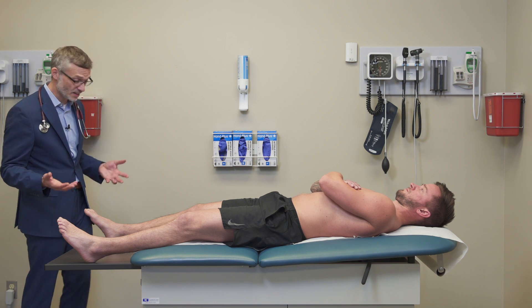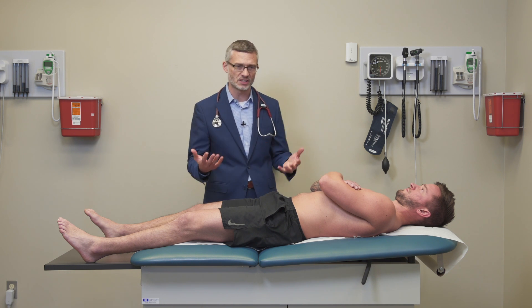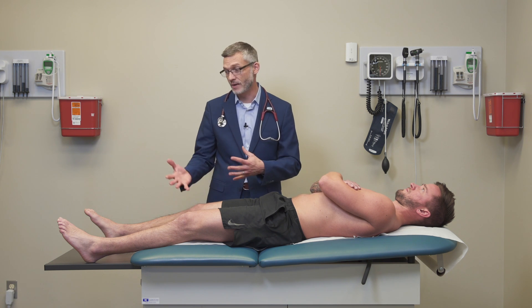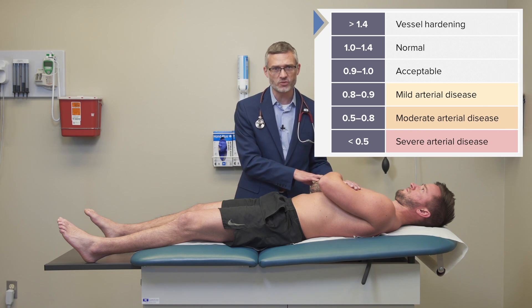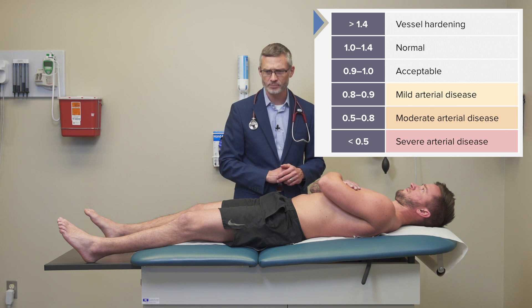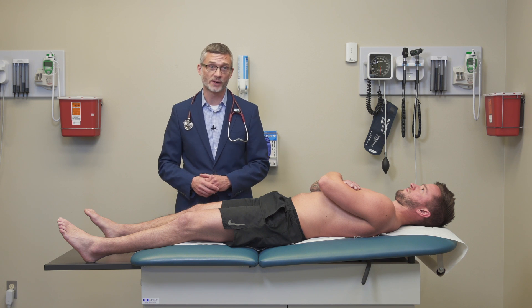The third piece and the most important when trying to diagnose subclinical peripheral arterial disease — or disease that is manifesting with symptoms but not showing up in obvious ways on the exam — is the ankle brachial indices. This is essentially a test using simply a blood pressure cuff and a handheld Doppler to compare how well your arms are being perfused, as peripheral arterial disease rarely manifests in the upper extremities, compared with how well blood is getting down into the lower extremities.